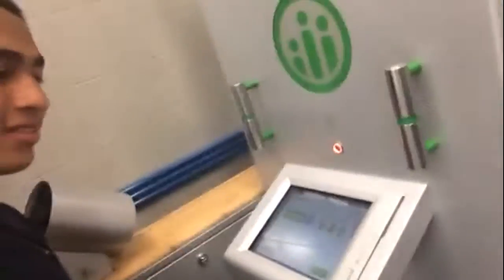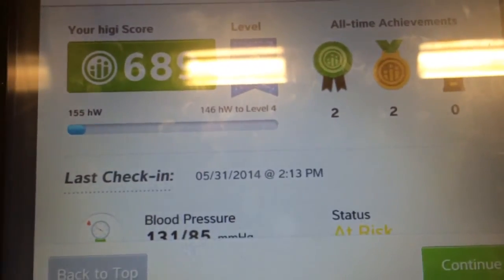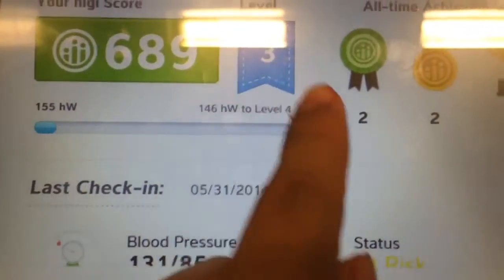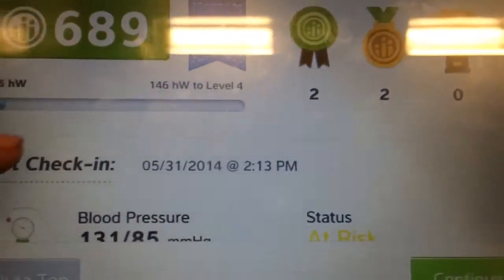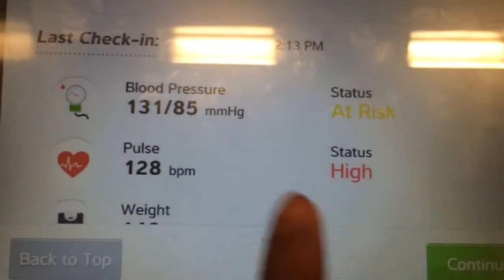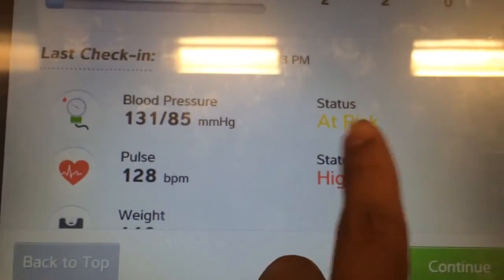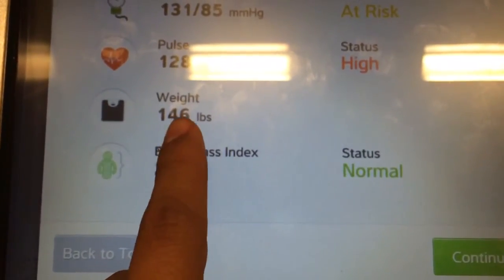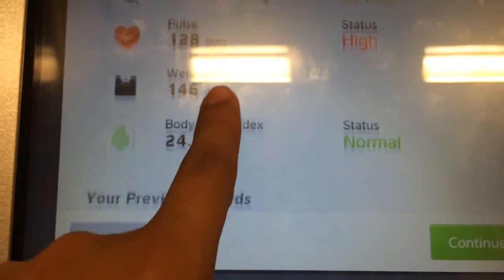Here we go, let's see. Good to see you again. Here is your last check-in result. So here are my results — I guess I'm at level 3 now. Pulse was 128, high, at risk. Weight was 146. Body mass index is 24, normal.